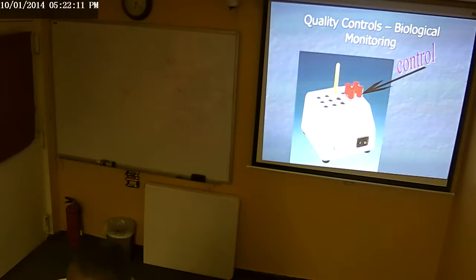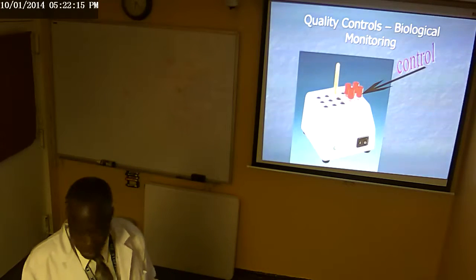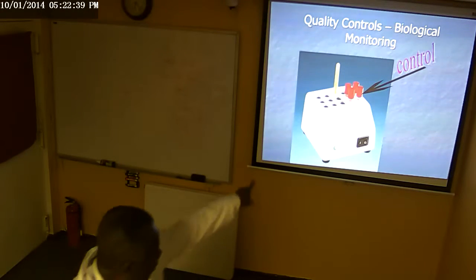And those conditions are what this machine is providing. If I take this geobacillus, crack it, and put it here, it's not going to do anything because the environment here is not suitable for it. If I want the organism to react, I have to give it the conditions appropriate for its survival, growth, and reproduction, and the machine is providing those conditions.